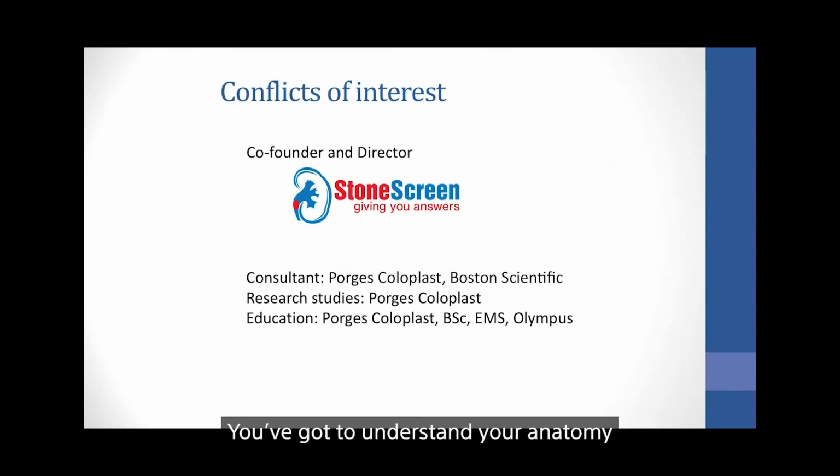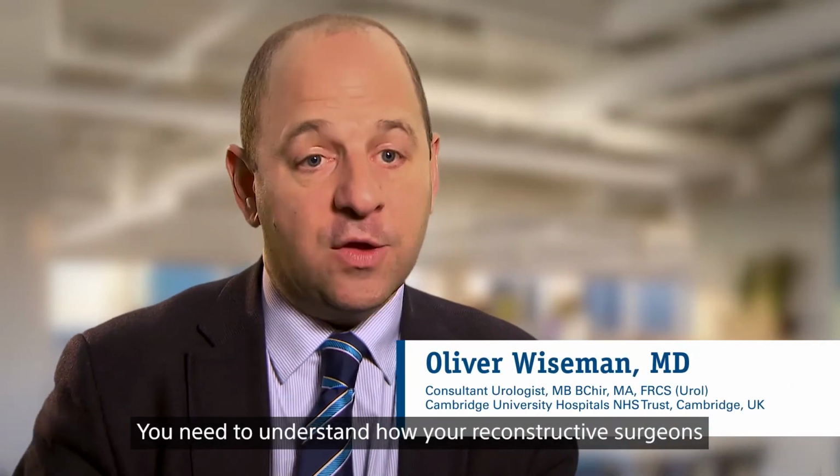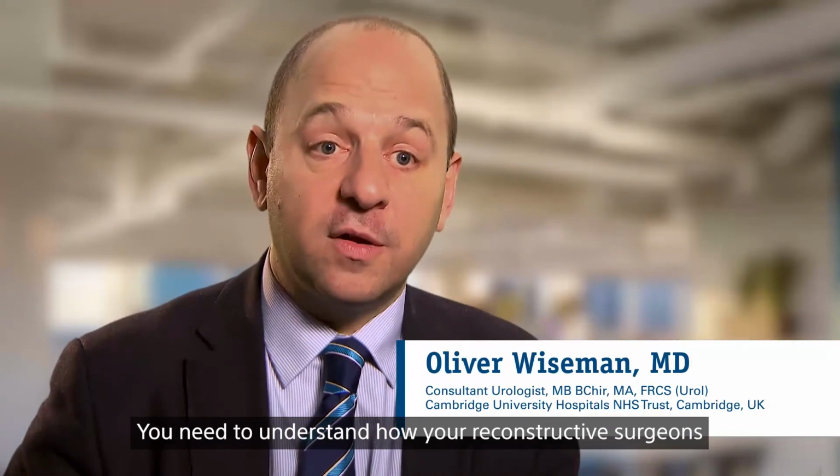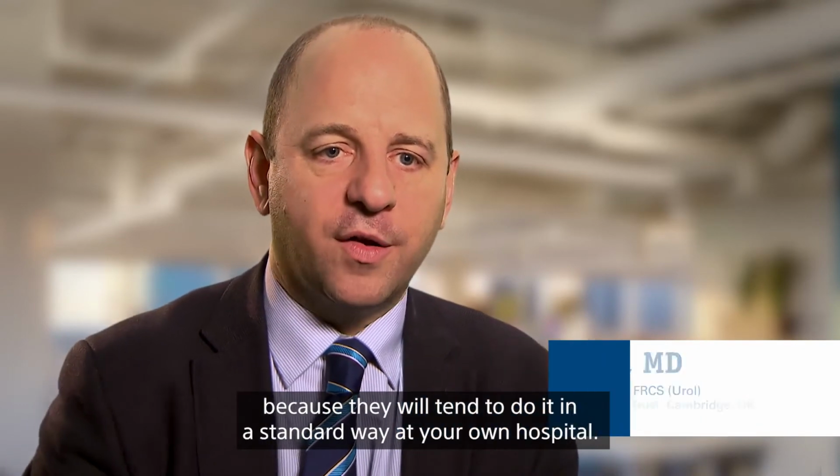You've got to understand your anatomy. So if you've got a neobladder, for instance, you need to understand that there'll be a chimney there. You need to understand how your reconstructive surgeons will have plumbed the ureters back into that, because they will tend to do it in a standard way in your own hospital.